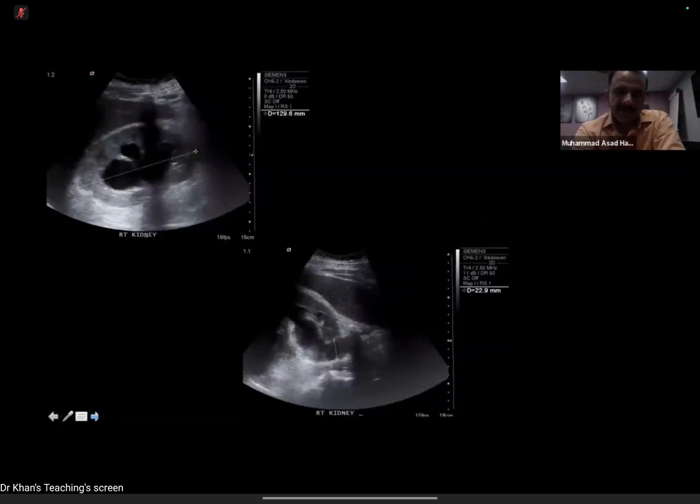Okay. Now, this patient did have that big cyst, which is not shown in these ultrasound images, but that was well known. Okay. On the ultrasound images, no direct communication between the pelvic calyceal system and the cyst could be seen. You have very rightly said that this cyst is potentially troublesome. The reason it is troublesome, if we get our first needle puncture into the cyst, we cannot move forward till the time the cyst is fully drained itself. Okay, it becomes very difficult to advance the needles.